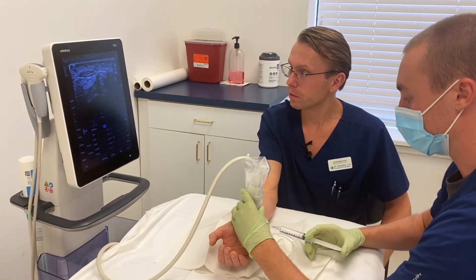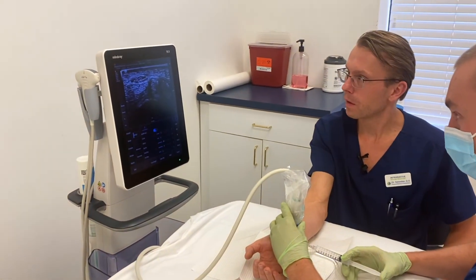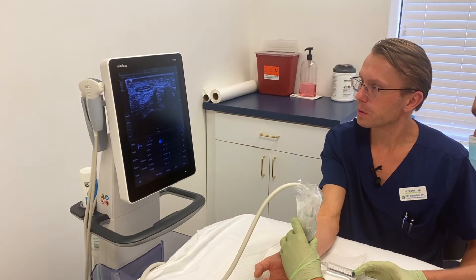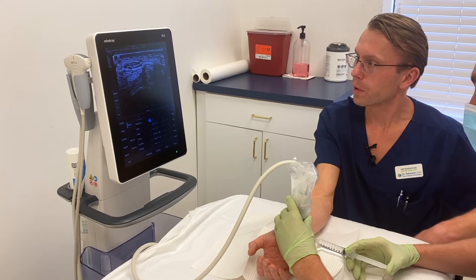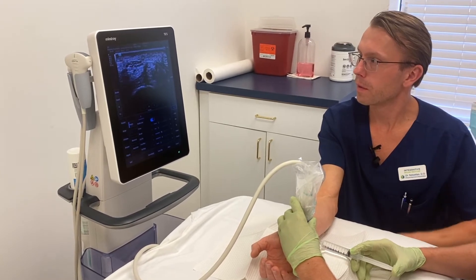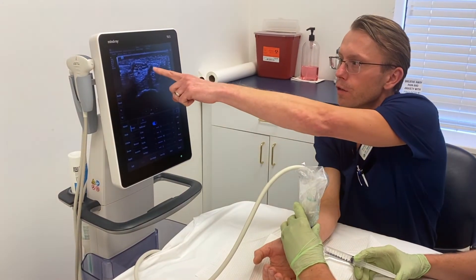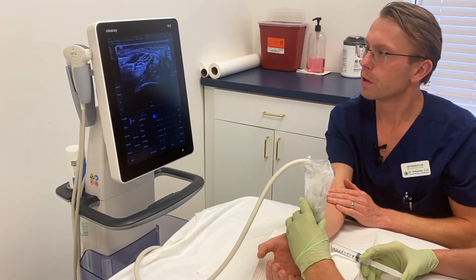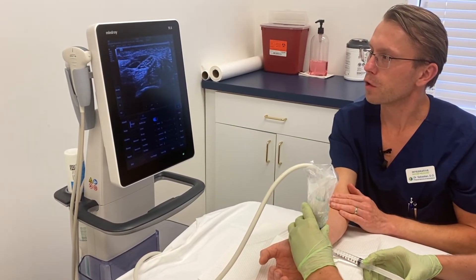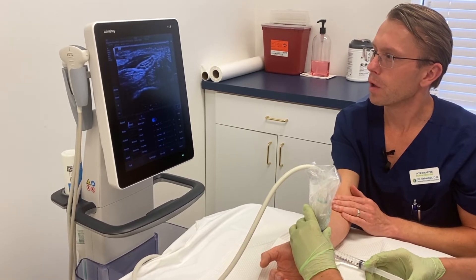Floyd has identified the nerve. You will see the needle approaching the nerve from the left side — there is the nerve and there is the needle approaching. Now there's the fluid spreading right above the nerve, and you can actually see the nerve being pushed down away from the ligament.